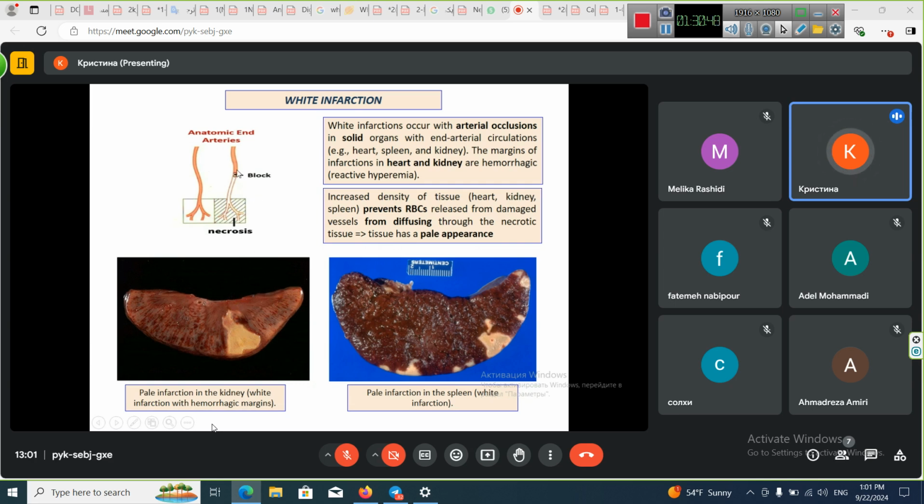So something had blocked the passage of blood to this area and it caused the necrosis in this triangular shape. So this is what we see here, a white necrosis area. Necrotic areas in spleen look almost the same, also usually triangular in shape.